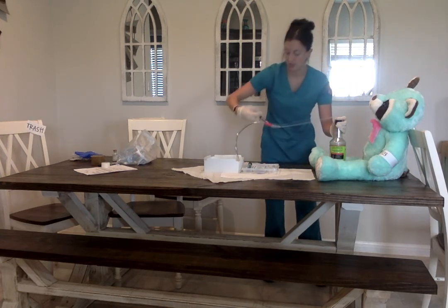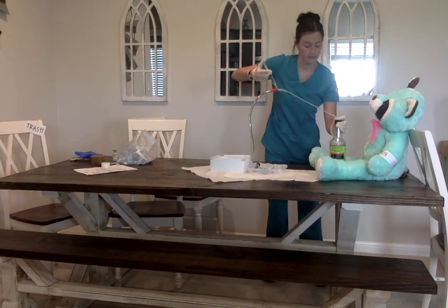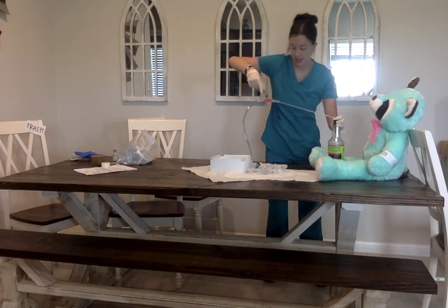I'm going to inject the 10 mLs of water here. You're doing really good. Okay. Alrighty. Okay, feel a little resistance, so we're good.